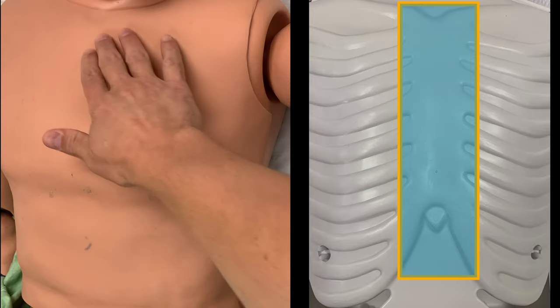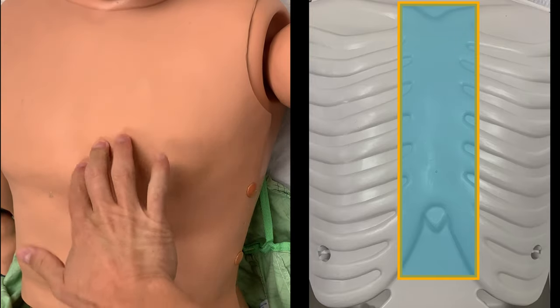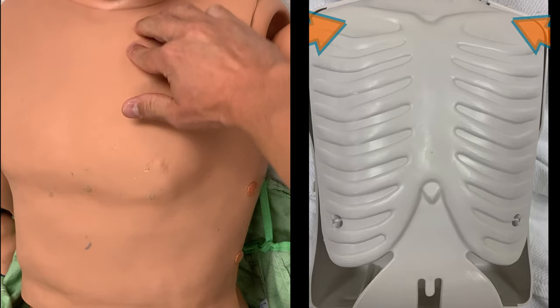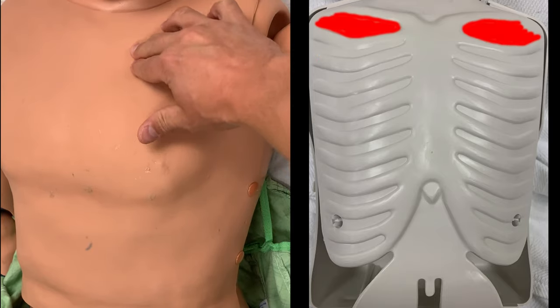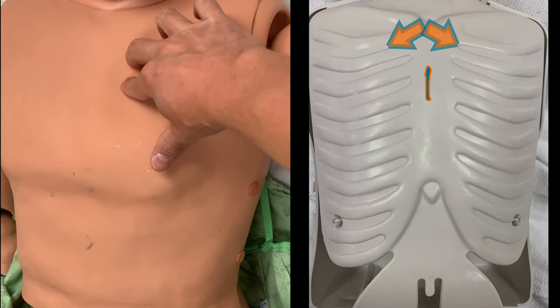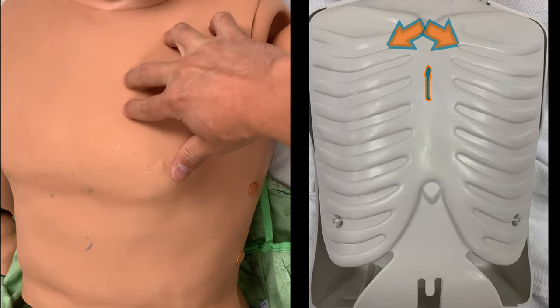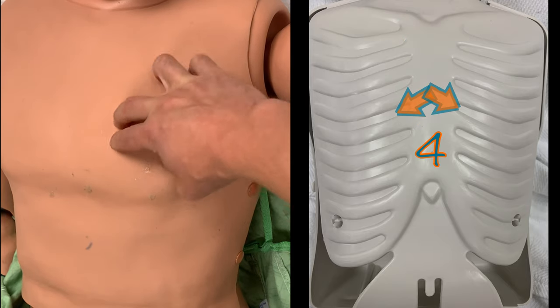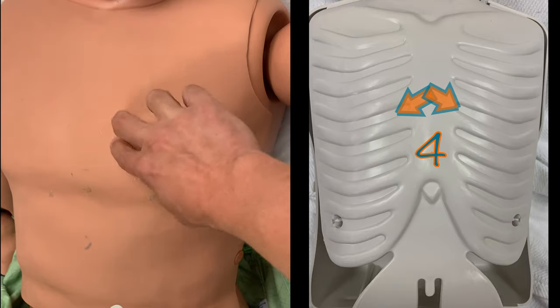Next, palpate the sternum and the clavicles. From there, you can feel down the chest to locate the ribs and intercostal spaces. The gap between the clavicle and the first rib is not an intercostal space. The gap between the first and second rib is the first intercostal space, and then the spaces between adjacent ribs are numbered sequentially moving down, 2, 3, 4, 5, etc.